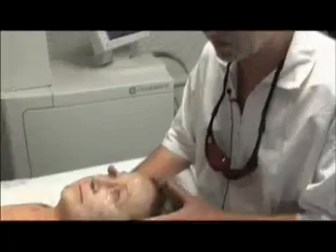However, no anesthetic injection was performed, either contact anesthetic or truncal anesthetic. There is no need to inject anything. Everything can be done by contact anesthetic.